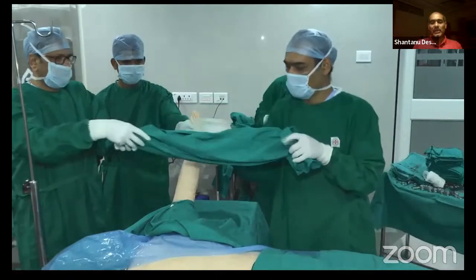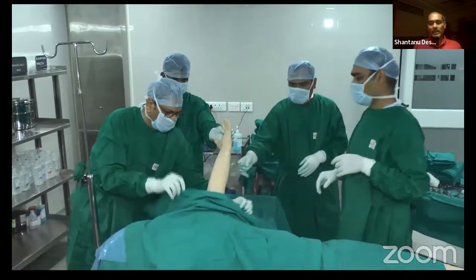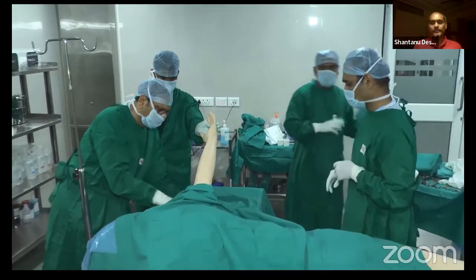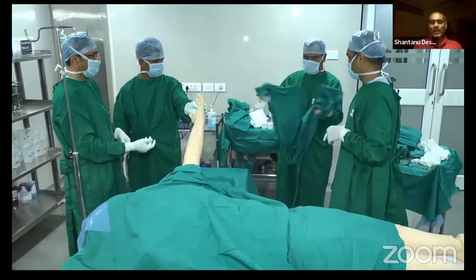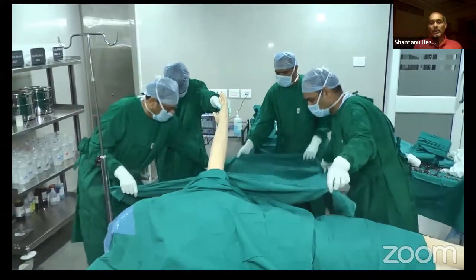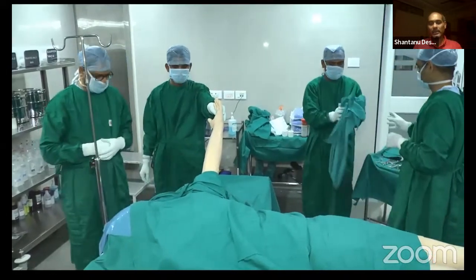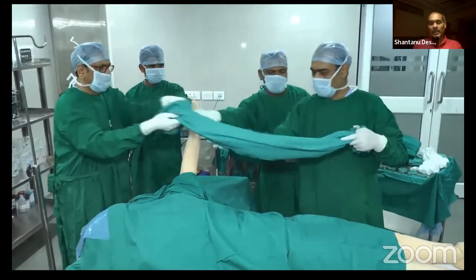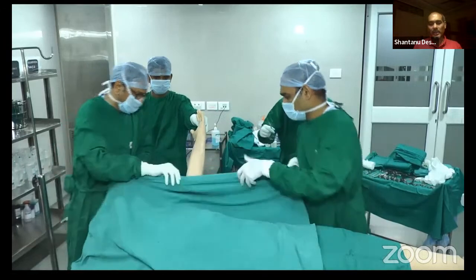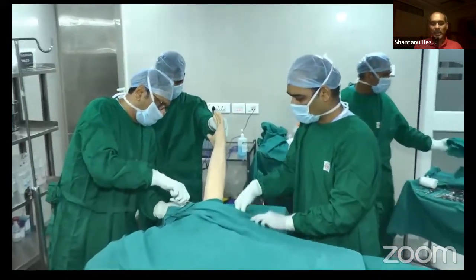Another big drape comes in, but now this is coming from the head end. The distal end of the drape can be turned similarly across the tourniquet lower edge, and it is secured with the clamp. Now the second layer onto the trolley comes, covering the edges of the axilla and the head area. Another big drape comes. This drape is covering the proximal part of the head, the anesthesia tubes and lines, and almost going on to the opposite limb.